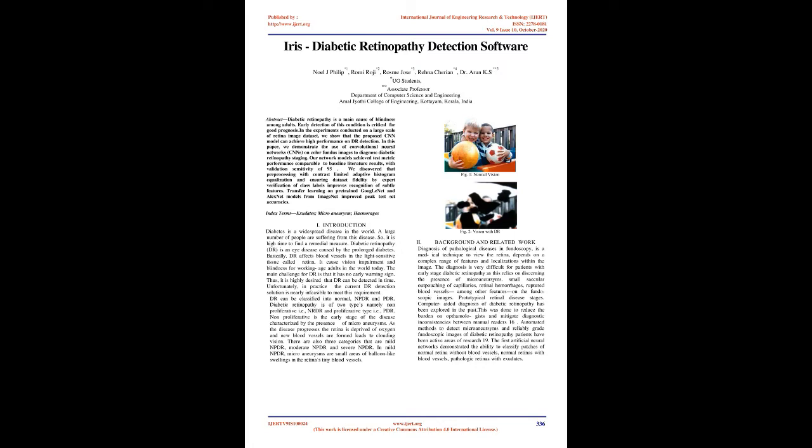In this paper, we demonstrate the use of convolutional neural networks, CNNs, on color fundus images to diagnose diabetic retinopathy staging. Our network models achieved test metric performance comparable to baseline literature results, with validation sensitivity of 95. We discovered that pre-processing with contrast-limited adaptive histogram equalization and ensuring dataset fidelity by expert verification of class labels improves recognition of subtle features. Transfer learning on pretrained GoogLeNet and AlexNet models from ImageNet improved peak test set accuracies.